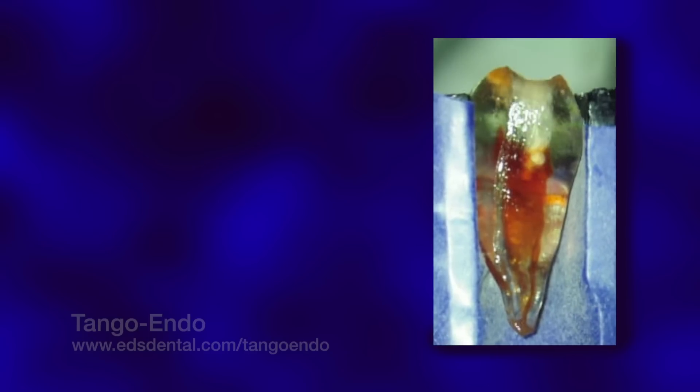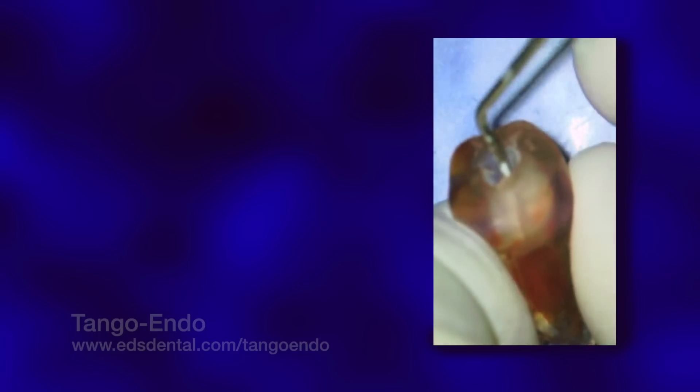We first gain access to the pulp chamber in the traditional manner, here using a No. 4 surgical length high-speed round bur. Our explorer confirms that we have gained access to the distal root. From the occlusal, we can see that the pulpal configuration is highly oval, wide in the buccal-lingual plane and much thinner in the mesiodistal plane. It should be noted that the pulpal anatomy mirrors the external anatomy of the root. The distal pulp space is somewhat C-shaped, reflecting the concavity present on the furcal side of the root, further emphasizing the thin mesiodistal width.